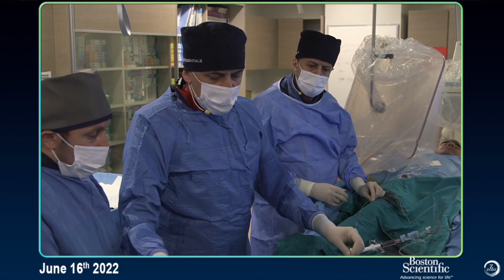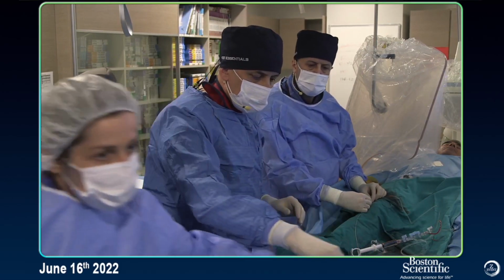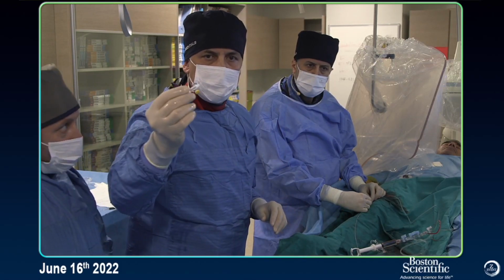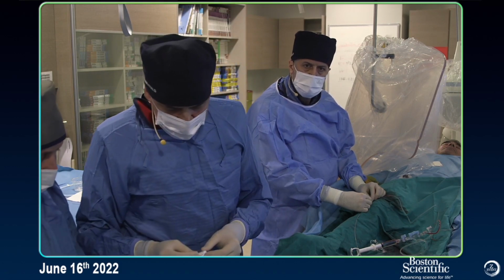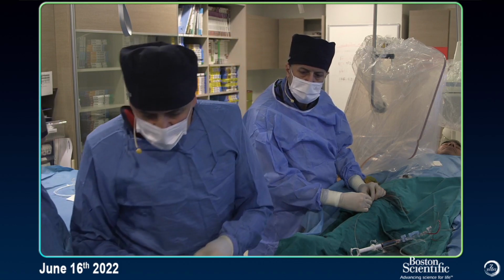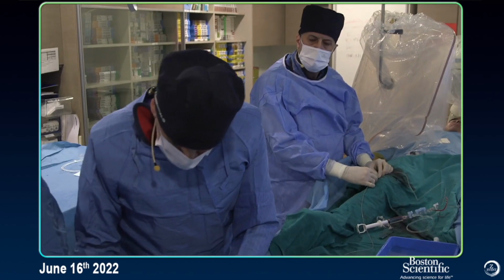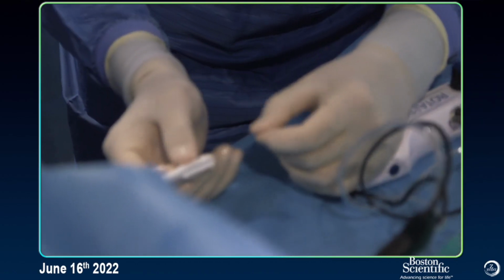And now I insert my burr. So, where is the wire clip? This wire clip is a very important tool. Before testing, the wire clip should be set at the end of the wire. Otherwise, when we do the test, the wire will kink. If you can have the camera right at the bottom, yeah, great.